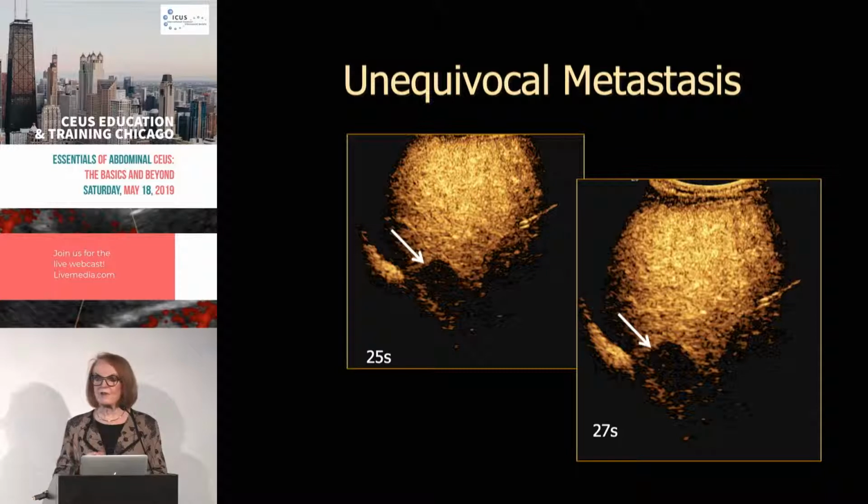Those are the big cancers where the patient has a high likelihood or a high risk for developing metastatic disease involving their liver. All of those major cancers have protocols that are adhered to all over North America, so they're the same where I am as where you are. Every so often, starting at 6 months of the patient's post-treatment interval, they have a CT scan. These CT scans are performed almost without exception in the portal venous phase only, looking for metastatic lesions.